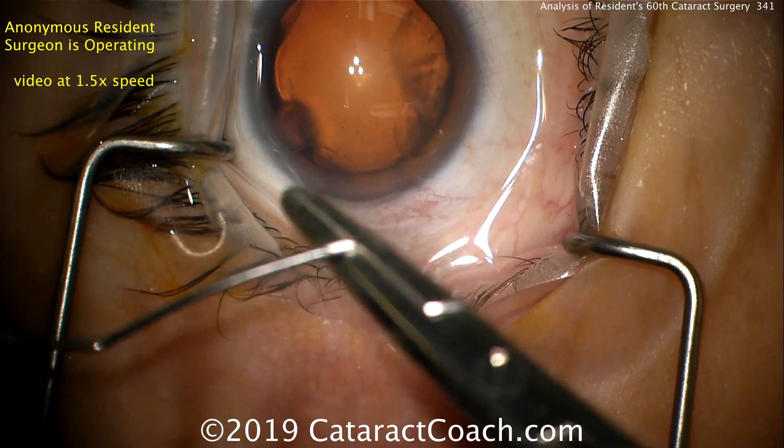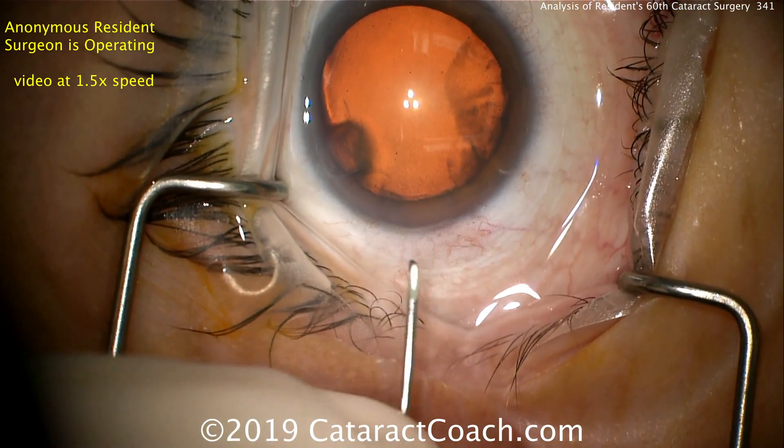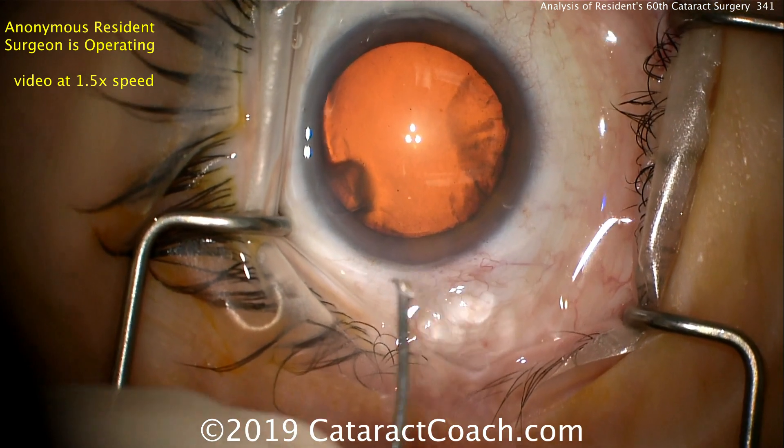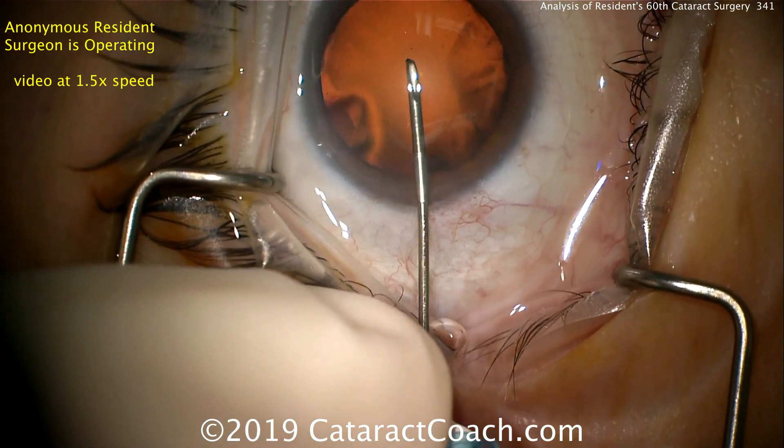Now here the resident is using a forcep, or needle holder, to bend his own cystotome. I like that idea. You can see the cystotome is on a viscoelastic syringe — that's helpful, I like the idea.